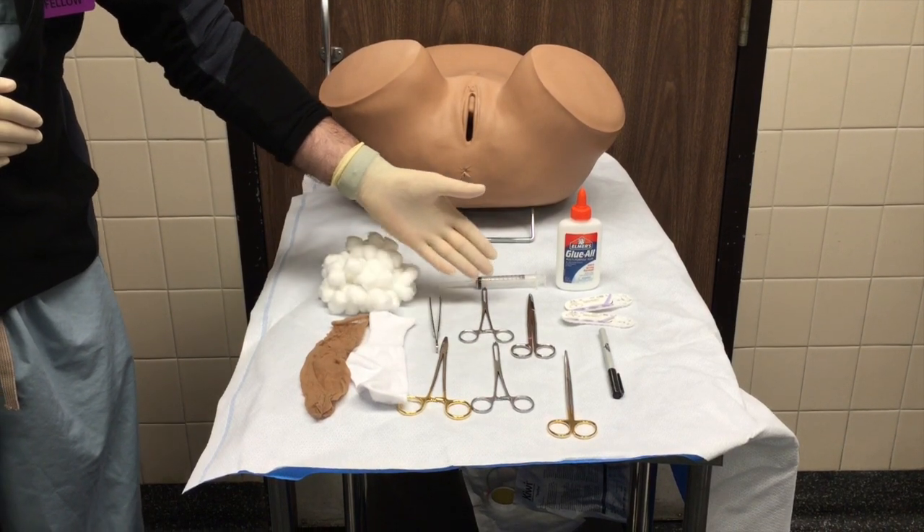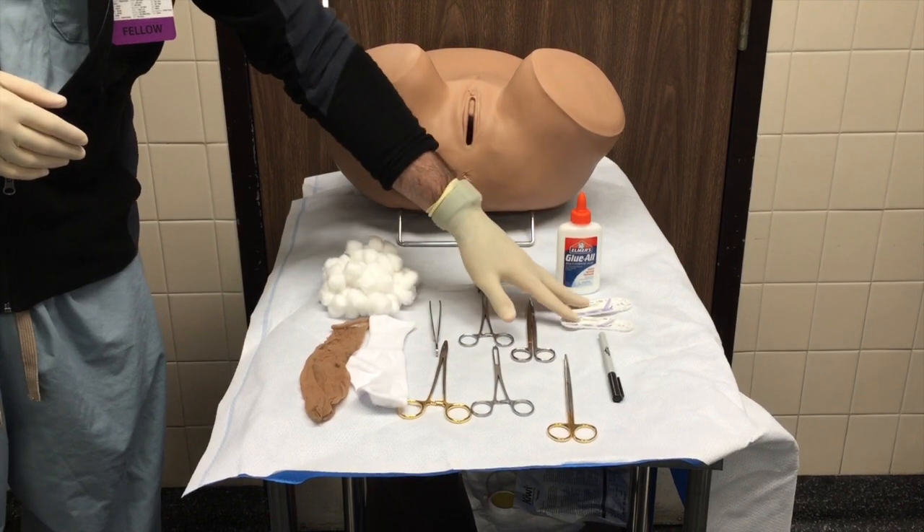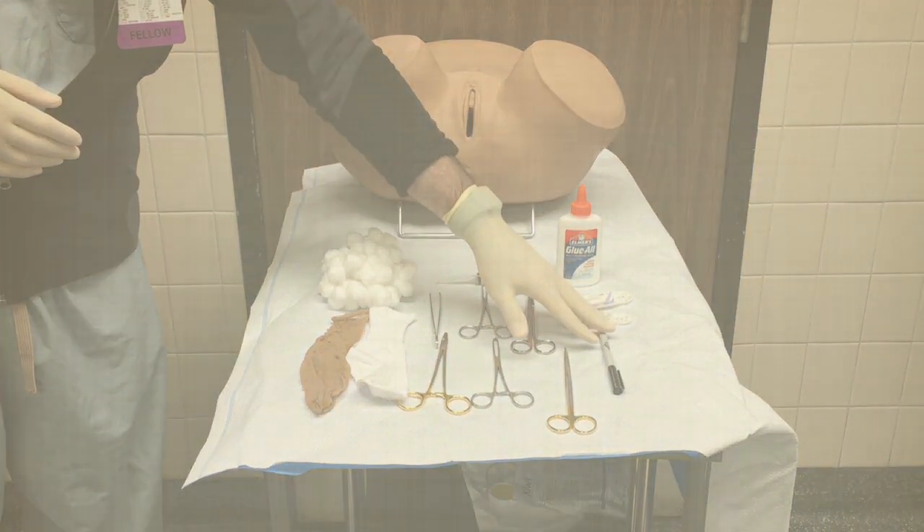Additional supplies include sutures, glue, a marking pen, and a pelvic model that is optional. The total cost excluding instruments is five dollars.